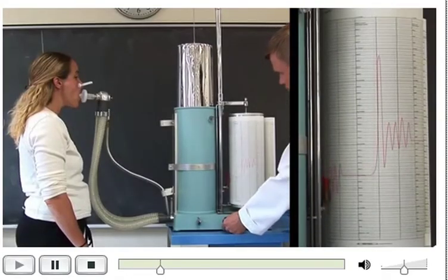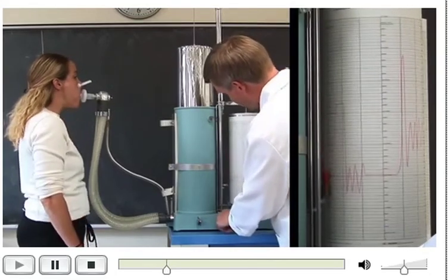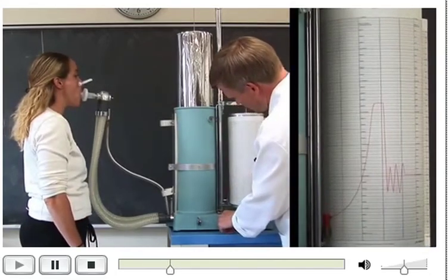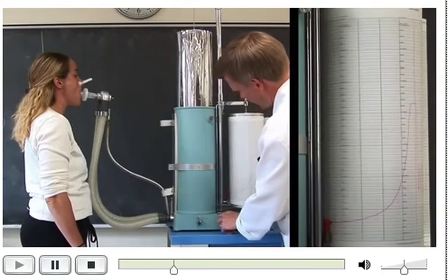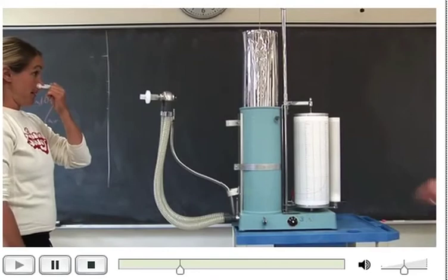And I want you to take a big breath in, pause, and blow it out as hard as you can. Blow, push, push, push, push. Okay, come off. Okay, take a break. We got time.